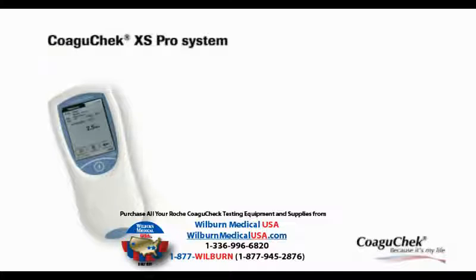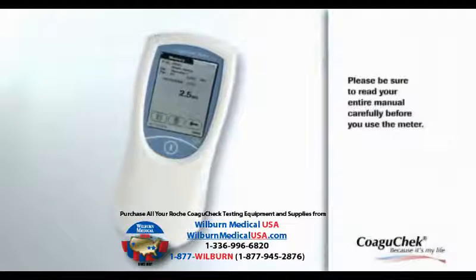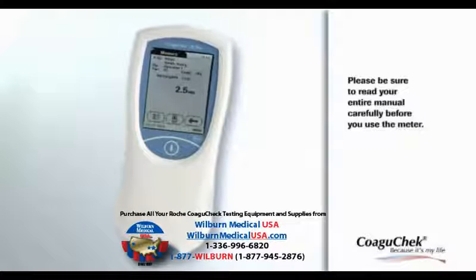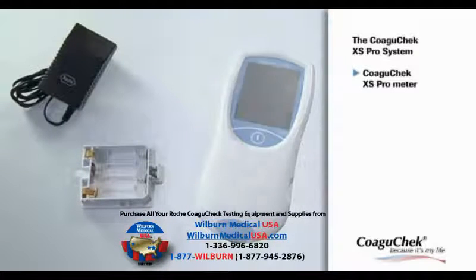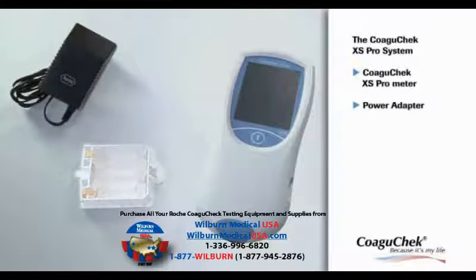Kowagicek XS Pro. Please be sure to read your entire manual carefully before you use the meter. You can use the Kowagicek XS Pro meter either with the power adapter or with batteries.